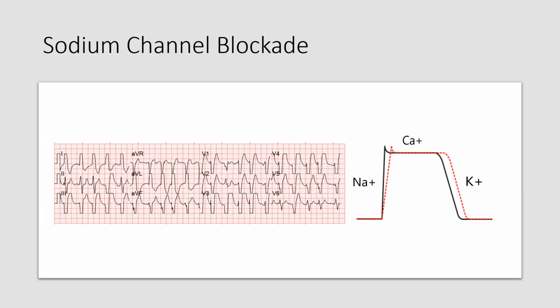All right, so sodium in and of itself doesn't typically have a major effect on the ECG. It can cause arrhythmias in severe cases, but you're more likely to see neurologic changes way before, so things like seizures. Part of that is attributed to the fact that sodium is just so much more prevalent outside the cell in comparison to some of the other electrolytes, and so you can have pretty big fluctuations and it doesn't show major effects.